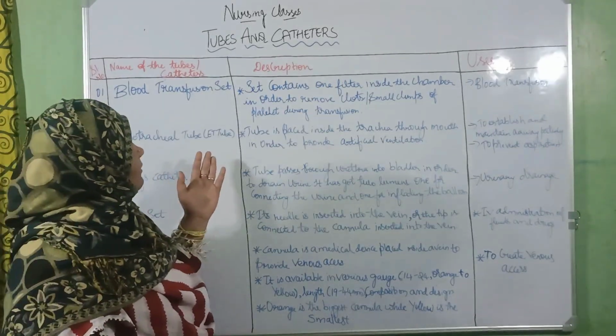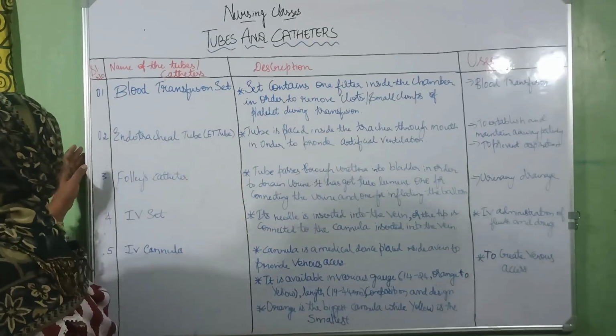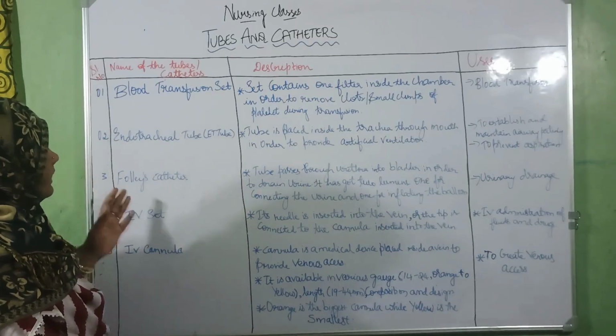Today I am going to deal with the topic tubes and catheters. So in this we will deal with the tubes as well as the catheters.